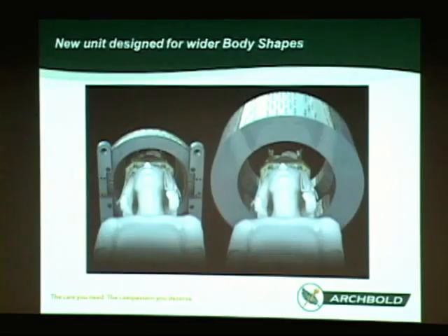The difficulties were, you know, moving them inside that automatic positioning system was very, very difficult. And it required a lot of acrobatics amongst us to be able to treat tumors in various parts of a person like this. You know, it was really difficult. So the new machine, as you can see, this is the opening for the old C unit right here. It was like this. So this was the helmet, you see. And then we had this positioning system that attached. So you had a lot of physical constraints with the old machine. But here's what the opening to the new one is like. I mean, by comparison, it's huge.